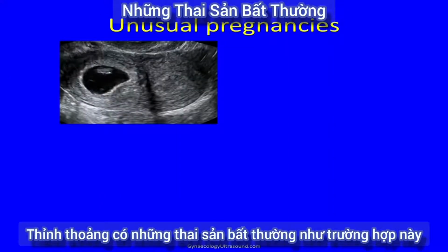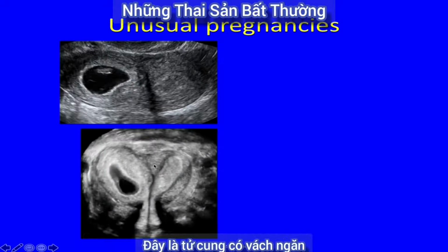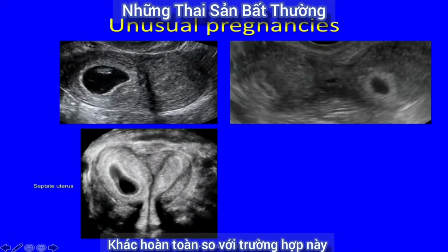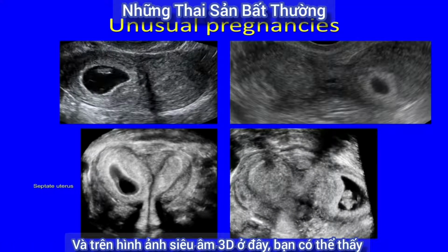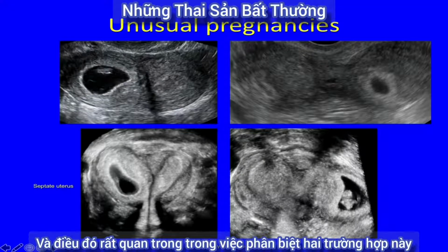Sometimes pregnancies are unusual, as in this case. Here you've got a pregnancy in one horn and an empty uterine cavity on that side. And on 3D it was instantly obvious that this is a septate uterus with the pregnancy in one horn there and an empty endometrial cavity on this side. That's a very different scenario to here, where the pregnancy is in this side and this bit of endometrial cavity is empty. And on a 3D view here, you can see that this is a unicornuate uterus. This is the endometrial cavity of the unicornuate uterus. And this is a pregnancy in the rudimentary horn. And how important to be able to tell these two apart.